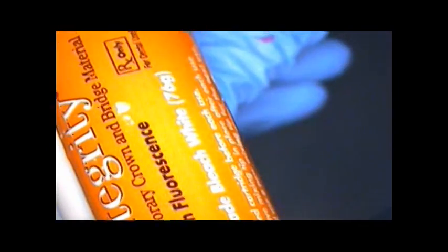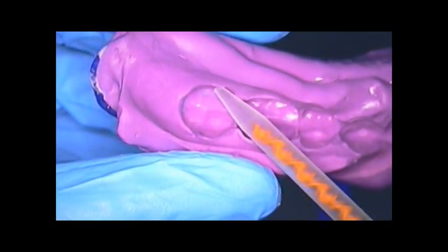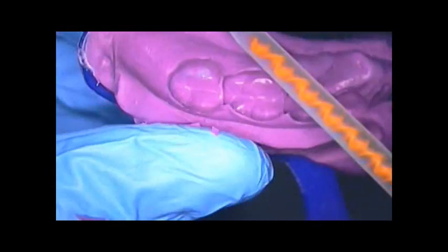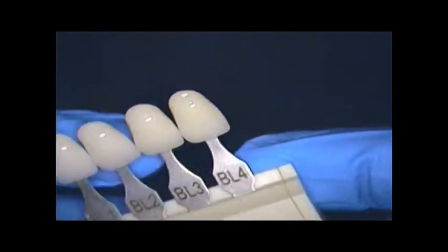Now this is the Integrity. This is the actual material I'm going to use to inject into the alginate, and then I'll inject a little bit in the mouth. So while we're waiting for the impression, it's good to have everything ready. She's going to have a bleach shade to match up to her adjacent crown.